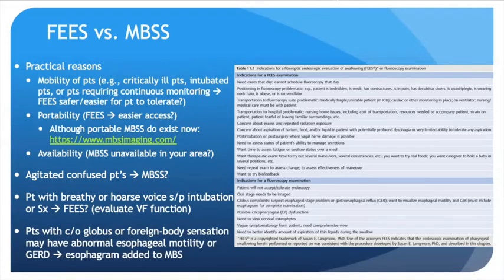You might choose one or the other due to practical reasons. Maybe the mobility of the patient is an issue. Maybe critically ill patients or intubated patients or patients requiring continuous monitoring. You might find that a FEES is safer and easier for them to tolerate, perhaps. Or maybe it's less easy for them to tolerate due to the transnasal endoscope placement, perhaps. Portability might be an issue. FEES is oftentimes portable, although I should say that there are some modified barium swallow study services that are reasonably portable as well.